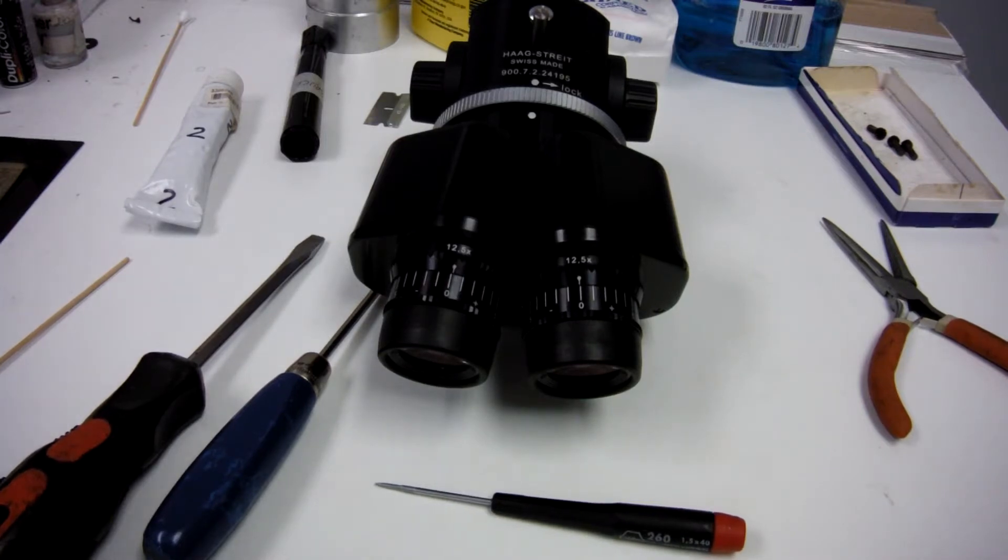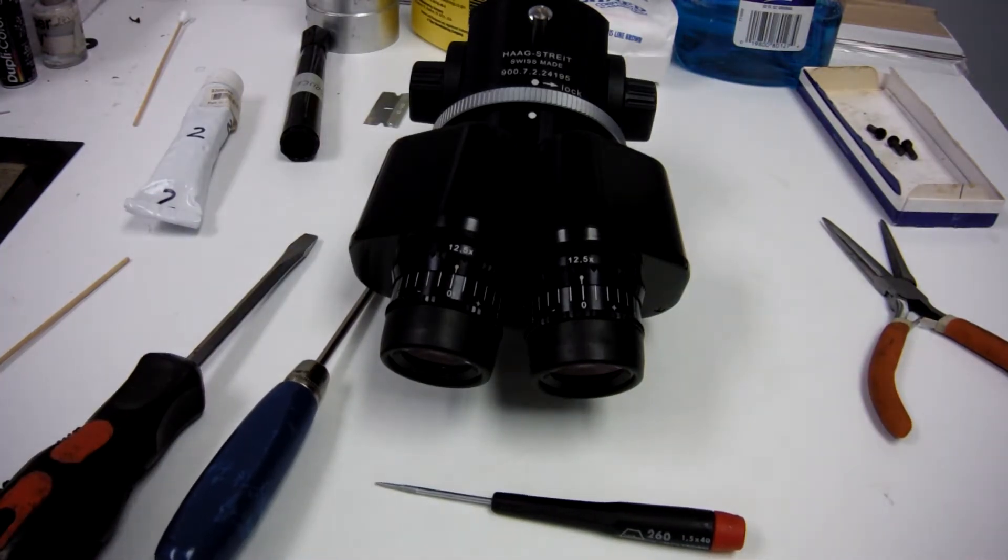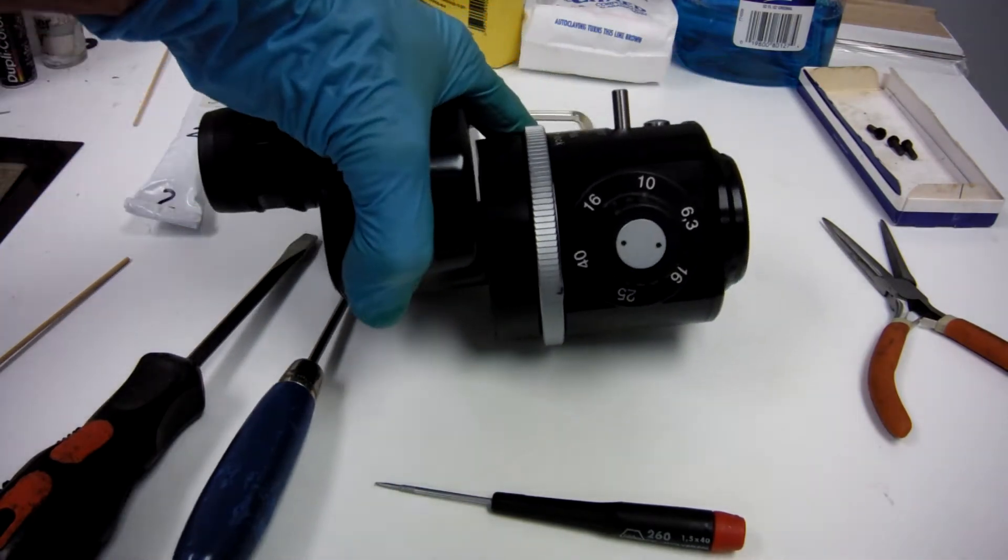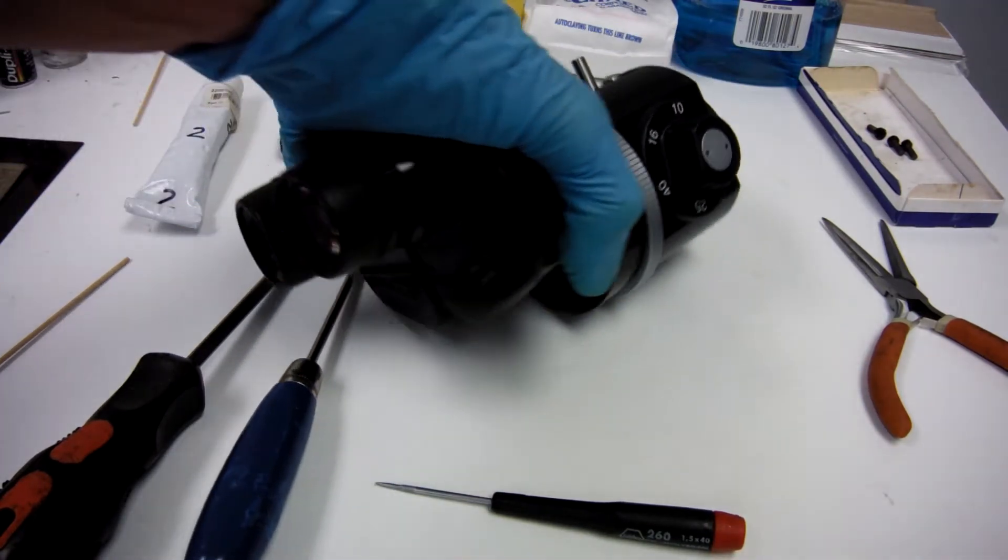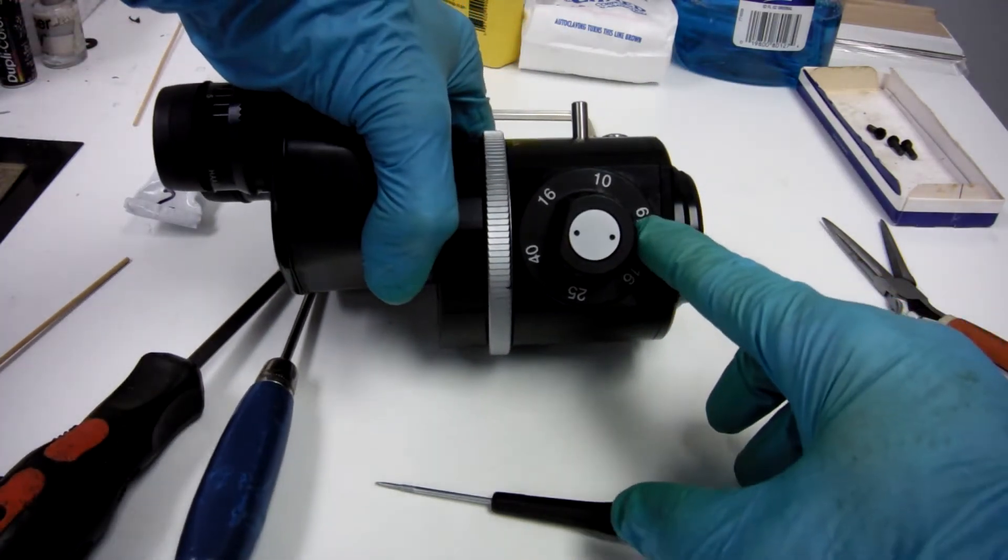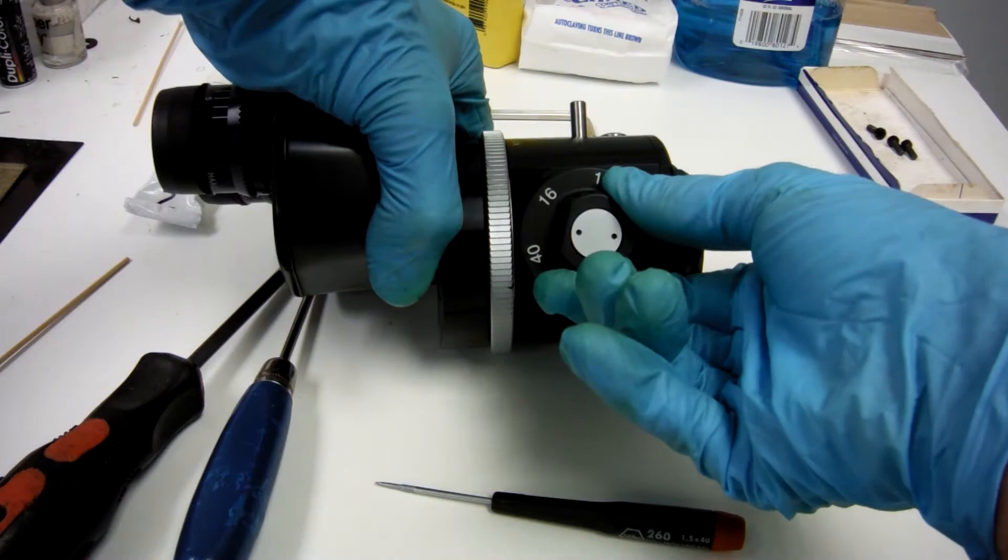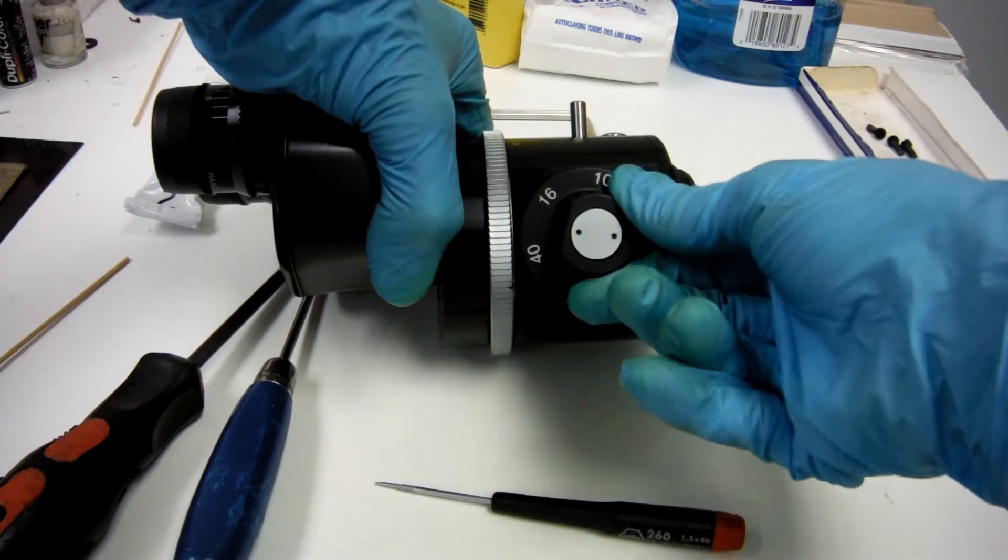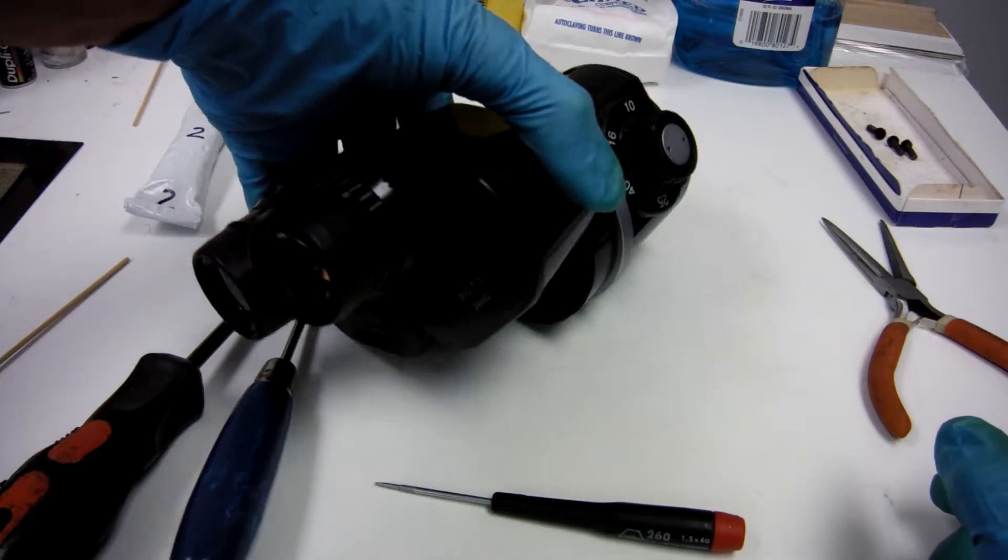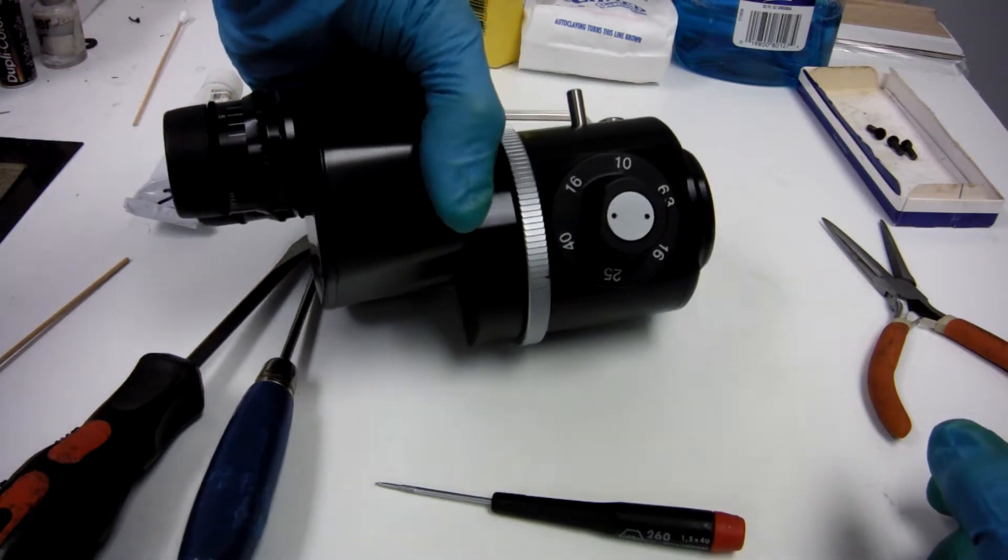Okay, this is a 900BQ with the rotating mag changer, and often times these mag changers get stiff, won't turn, and they need to be cleaned and re-lubed.